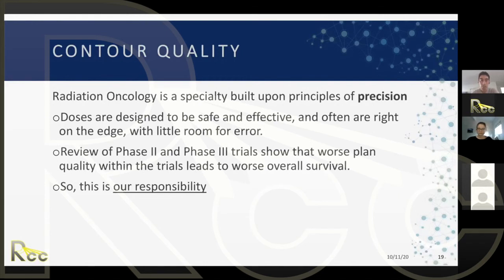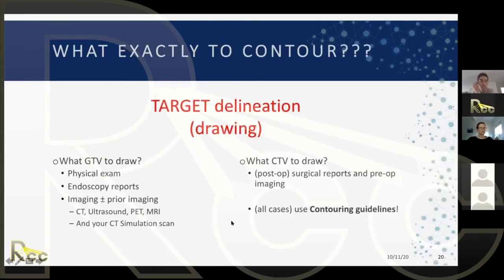And these little tests that we do, 1% threshold accuracy for some of our QA, the contour has to be just a little bit right. All of these things add up. And if we're sloppy here and sloppy here and sloppy here, at the end, we don't know actually what we've delivered.